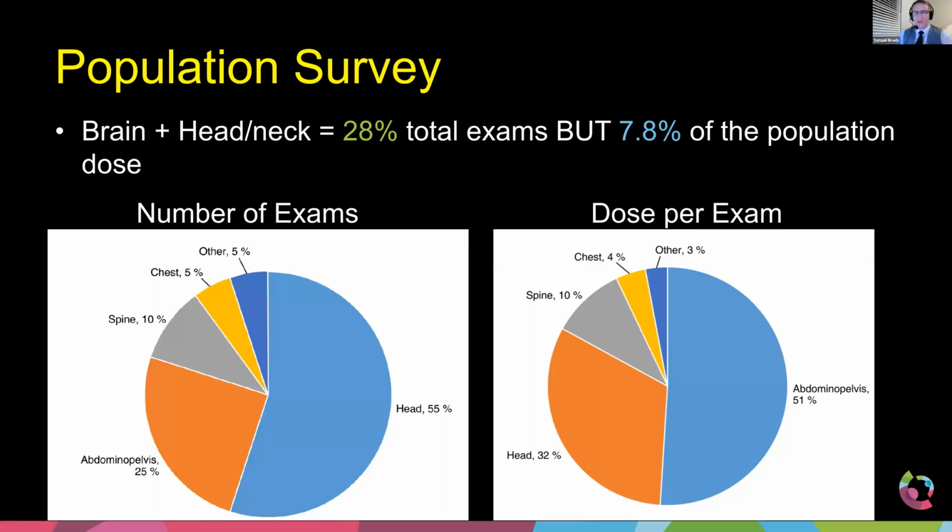And you guys, I strongly recommend that this is a direction that Thailand and everyone listening goes. As you now have established diagnostic reference levels, the next big step is to understand the overall burden. Well, burden is probably the wrong word. Usage or utilization. So, how much is going to CT versus planar radiography and mammography and fluoroscopy?